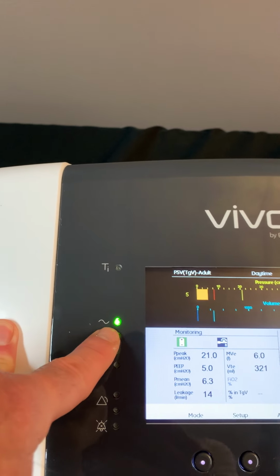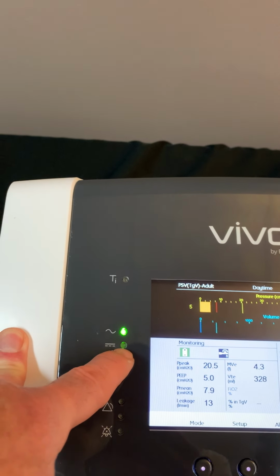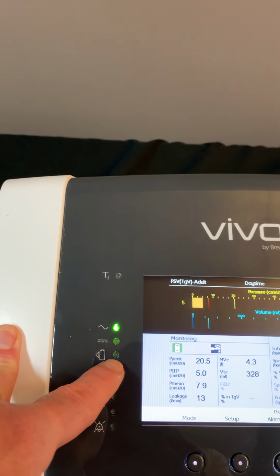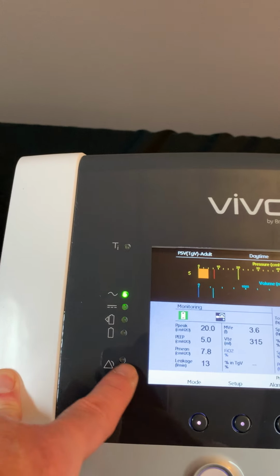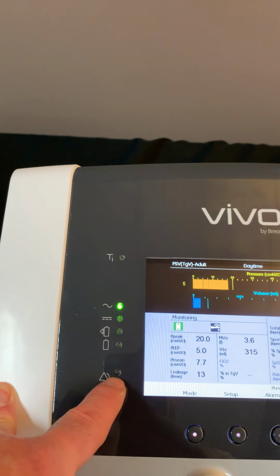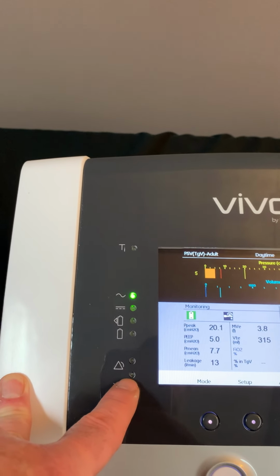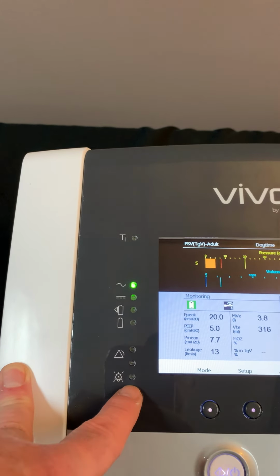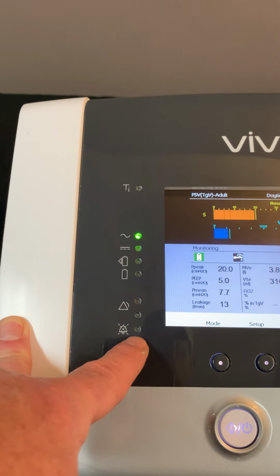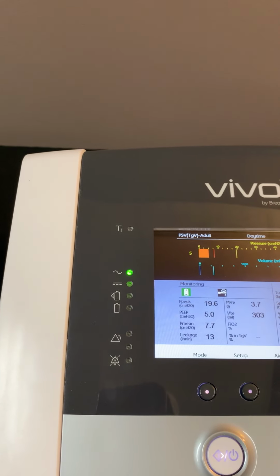You've got 4 LED lights here that signify the type of power that's running the machine. This one is labeled AC power, the top one, so I've currently got it plugged in. This is your DC power source. You've got external battery and you've got internal battery. These 2 LED lights next to the triangle: this top one is a red LED for a high priority alarm, and then you've got a yellow light for medium priority alarm, and then you've got an alarm silence. When you silence the alarm, that LED light will light up.